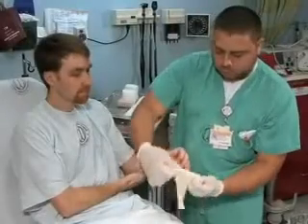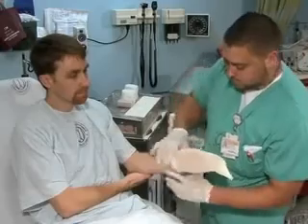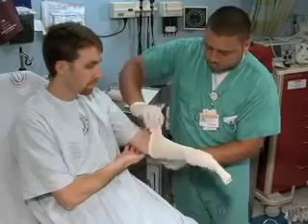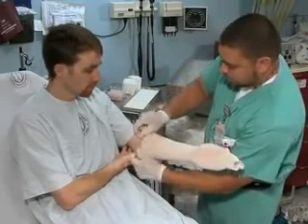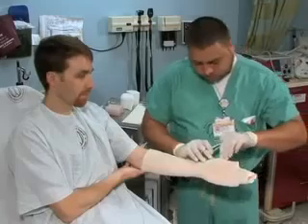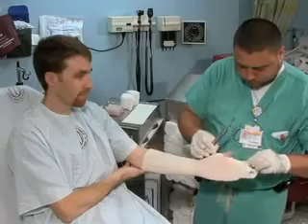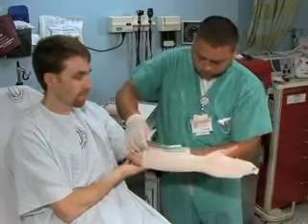This section demonstrates the application of a volar splint to an upper extremity. Apply the stockinette to the extremity, avoiding wrinkles and using sufficient length to extend 10 cm beyond each end of the splint. Use scissors to cut an opening for the thumb: cut a small hole in the stockinette where it lies across the base of the thumb, then pull over the digit to prevent wrinkles.